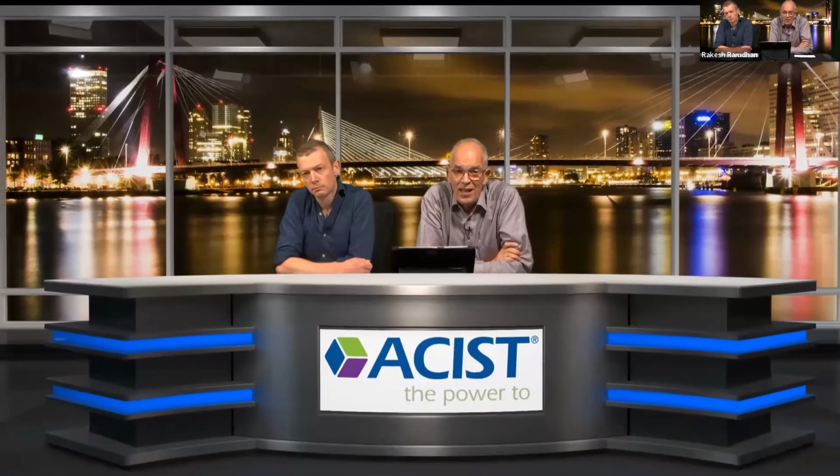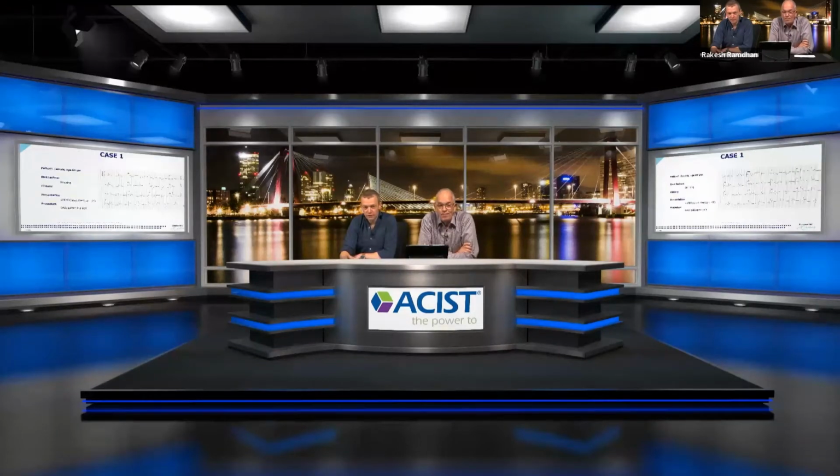It can be quite challenging to study the thrombus, but I think with this article, if you read that, and there are also some book chapters, then looking carefully and at ease, I'm sure that you will recognize thrombus. In STEMI and non-STEMI patients, those are the ones in which you have the biggest chance to meet it. Yep. All right, so first let's start with the first case.